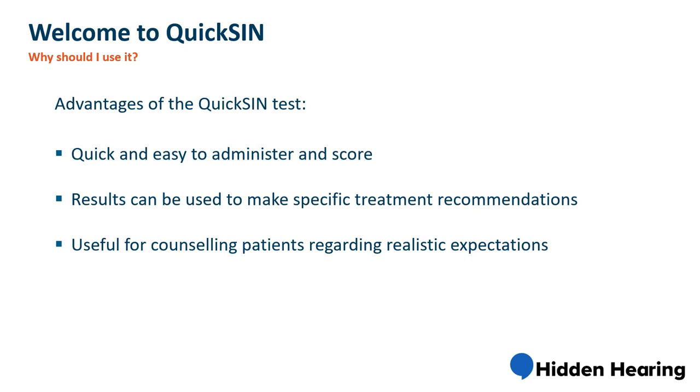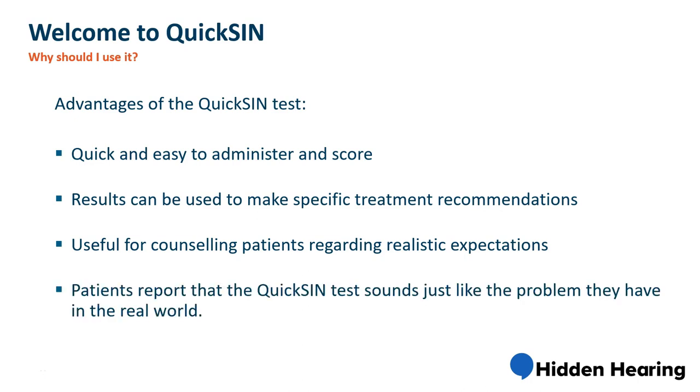It's very helpful in setting expectations at an early stage for your client. An additional benefit is that patients actually get a better indication of how they hear in the real world.